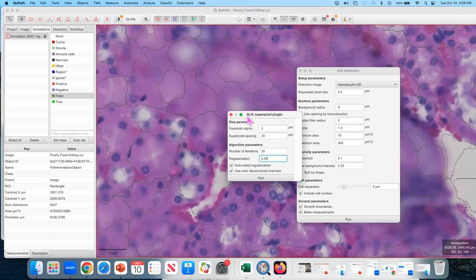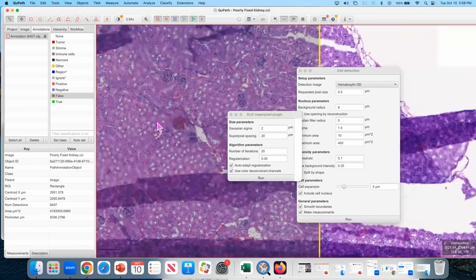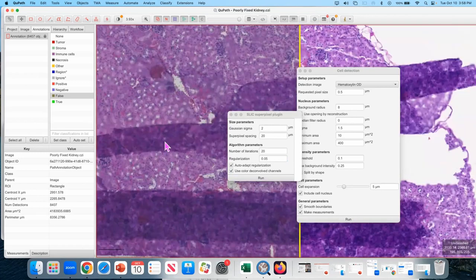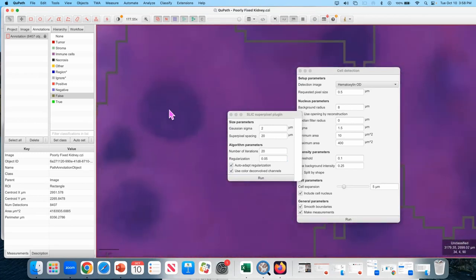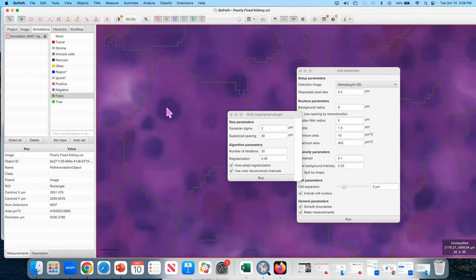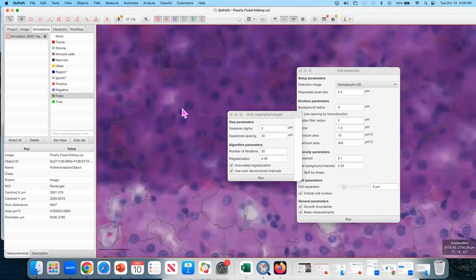And so I end up using it at times where, if you were to zoom in on just a couple pixels, you couldn't tell what type of cell you were looking at. If you were zooming really hard, you can't tell if this is a fold or just a densely stained region, because some of them are just dark. To really tell what's going on, you need to look at more context. But I don't just want to use a low resolution pixel classifier and deal with the blockiness of that.